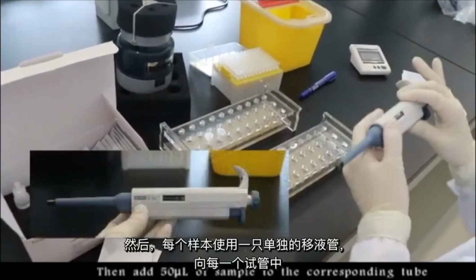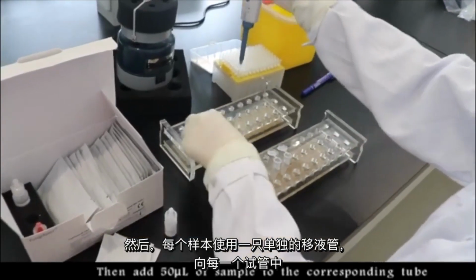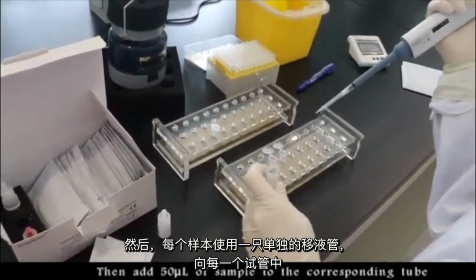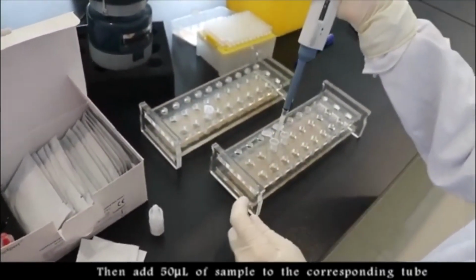You then transfer 50 microliters of sample into each of these tubes, using a separate pipette for each one.